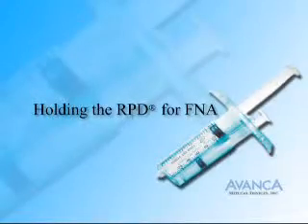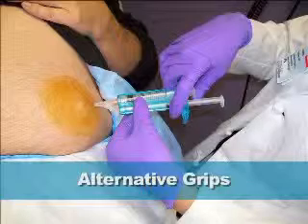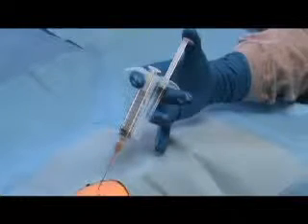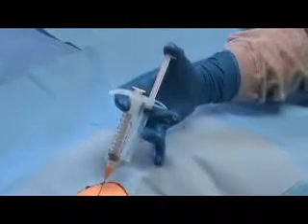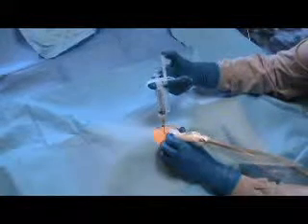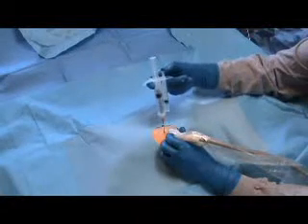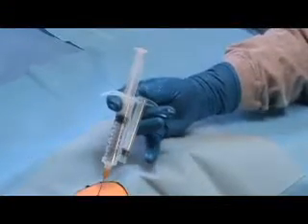Holding the RPD for FNA. The RPD can be held in alternative grips depending on the clinical situation. The one-handed classic syringe grip for FNA: the RPD is held with the index and middle fingers on the finger flanges, the thumb rests on the injection plunger, and the needle is introduced into the lesion. The free hand is used to palpate the lesion, operate the ultrasound transducer, or for other functions. The aspiration plunger is depressed with the thumb to generate vacuum for biopsy. The biopsy is taken with quick in and out motions.